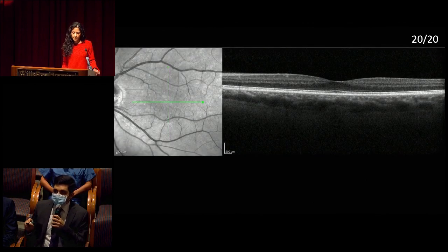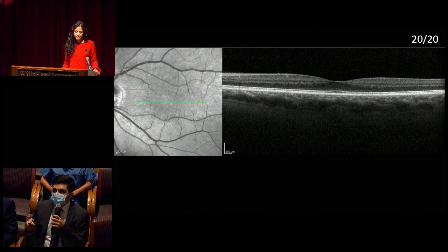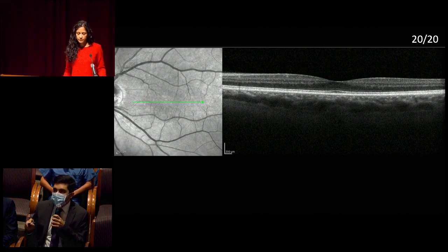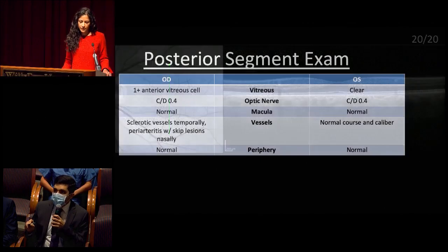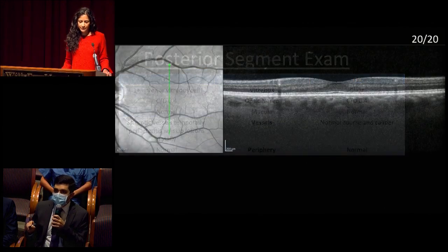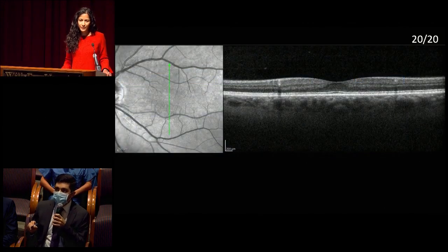Horizontal raster OCT of the left macula: vitreous is optically clear, choroid has normal thickness and appearance, and retinal laminations appear normal. Vertical cut — same, normal.